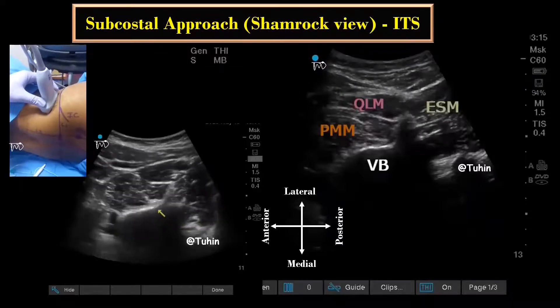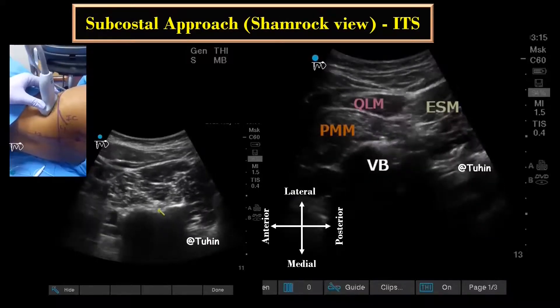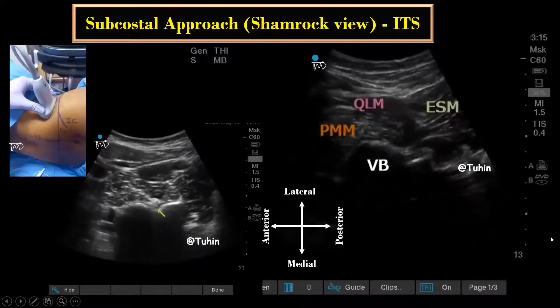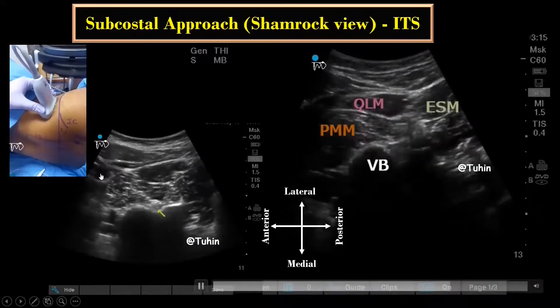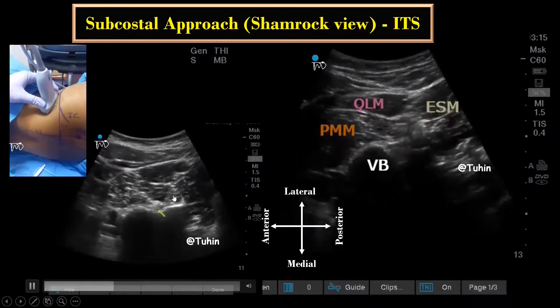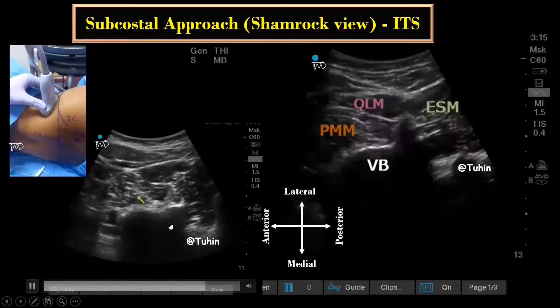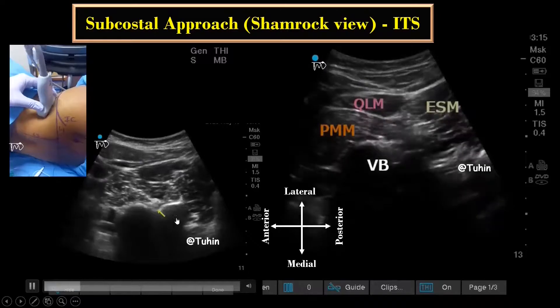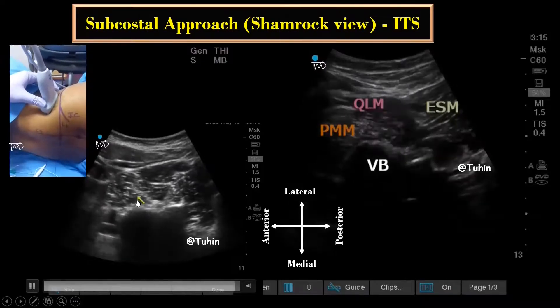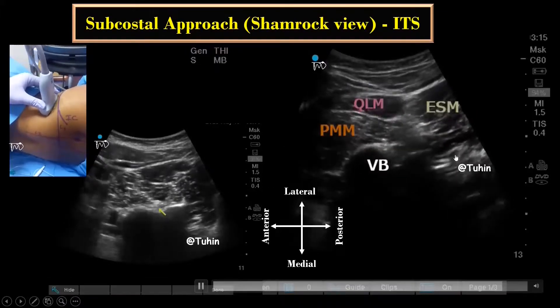The transverse process may act as a barrier during in-plane needling. Hence, once the sonographic pattern of the shamrock is obtained at the level of L3 or L4 transverse process, the ultrasound transducer is tilted slightly caudally — as you can see here — until the acoustic shadow of the transverse process is no longer visible. This view represents the anatomy of the lumbar plexus through the L3–L4 or L4–L5 inter-transverse space. By craniocaudal movement of the transducer, the course of the lumbar nerve root can be visualized as it comes out from the intervertebral foramen. The lumbar plexus elements appear as a hyperechoic oval structure in the medial and posterior part of the psoas major muscle, typically within a distance of 2 cm from the transverse process.